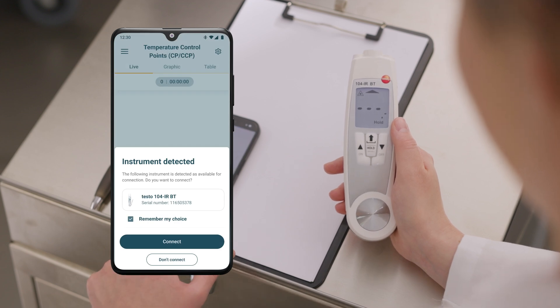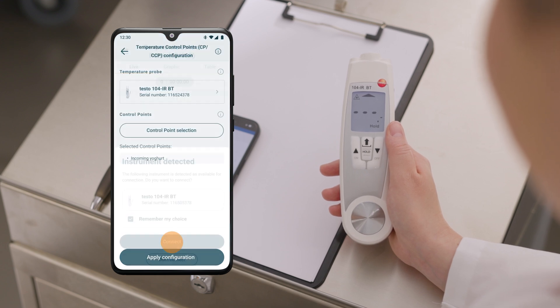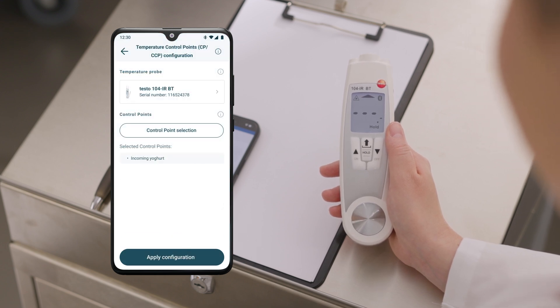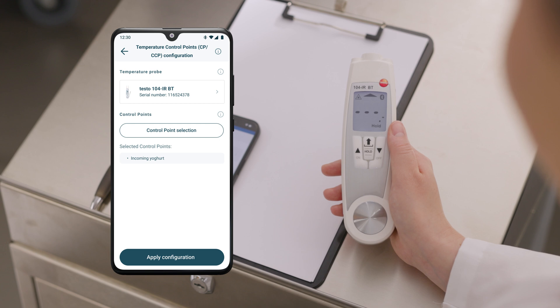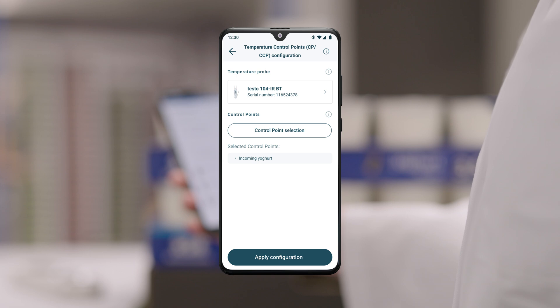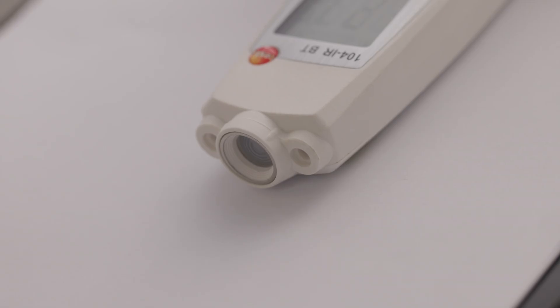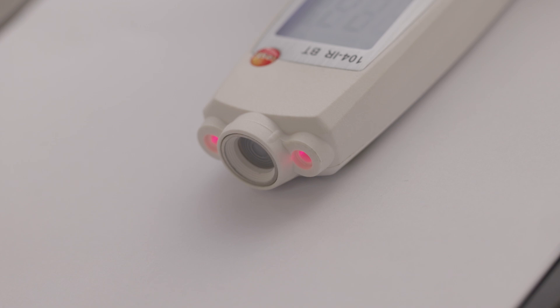Connecting the measuring instrument to the Testo Smart App is extremely easy — the app automatically recognizes the measuring instrument and saves the instrument connection for future use, enabling an even faster connection. Before you start the temperature checks, simply select the predefined control points and then start the measurement series. The infrared surface measurement takes place within seconds and is non-destructive, thanks to the support of two lasers on the measuring instrument.